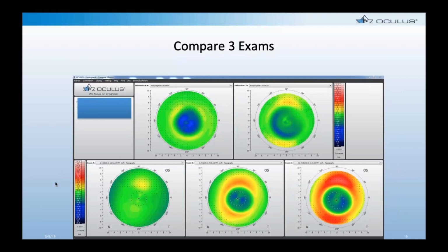So we talk about Ortho-K, especially in adult patients. We may say at first you may experience some nighttime vision issues, but the longer you do it, the better they get. Is that true or not? I think what you find when you do these comparison exams is that over time, even as you don't achieve any more central visual correction, sometimes if we stick with a treatment long enough, we do get a more complete and enlarged treatment zone, which does help patients with their nighttime vision, for example.